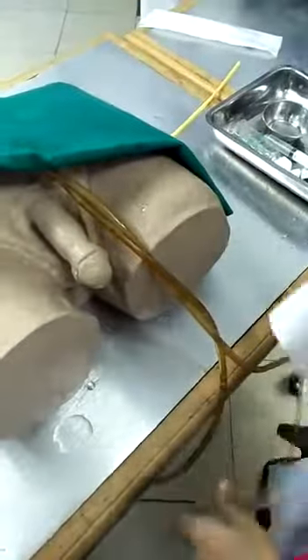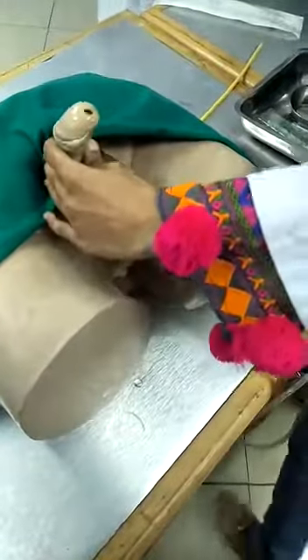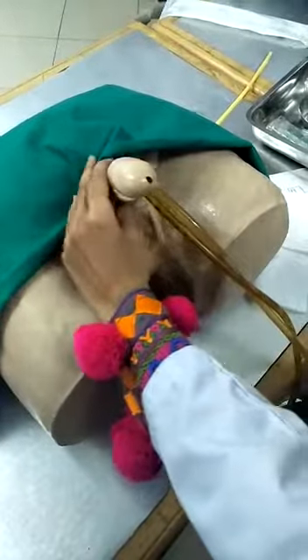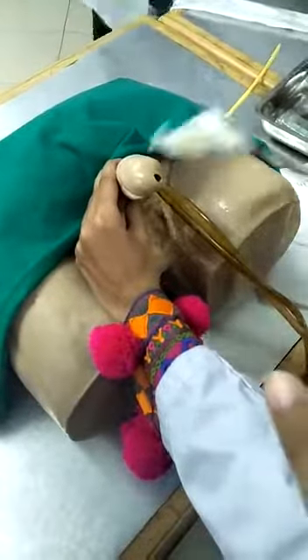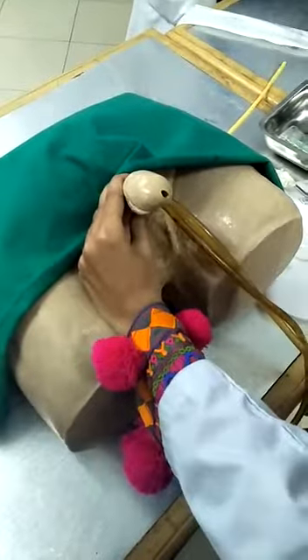For the male patient, first we have to maintain the position. The tray should be placed on this side. Hold the penis with your non-dominant hand in the perpendicular direction to the body, as it will ease the process. Then hold the gauze piece with pyodine gel and apply in a circumferential direction. Then use the distilled water.